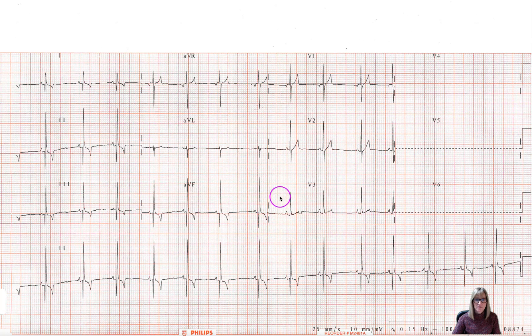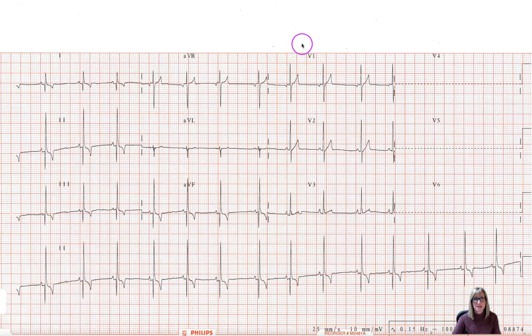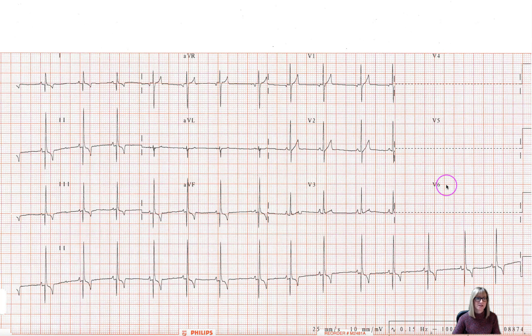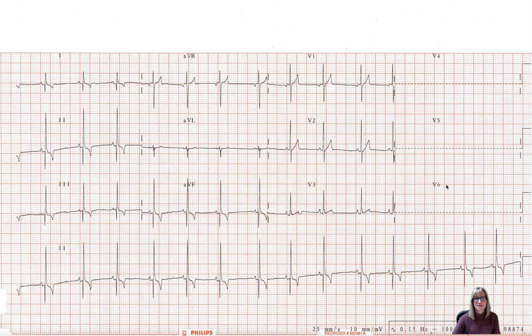And then again when we see these little vertical tick marks, the machine is switching yet again to display three separate lines of sight — in this case the chest leads V1, V2, and V3. And then finally at these last vertical marks, switching again to three other chest leads: V4, V5, and V6. Essentially we have an opportunity to see 12 different leads on these top three lines, and each of these leads represents a different perspective or point of view of that electrical activity moving through the heart over time. That's why they all look somewhat different from each other, and there's a lot of value to having these different perspectives, which will become apparent in subsequent episodes.